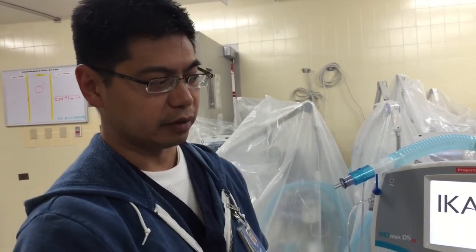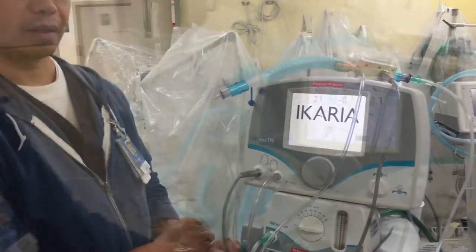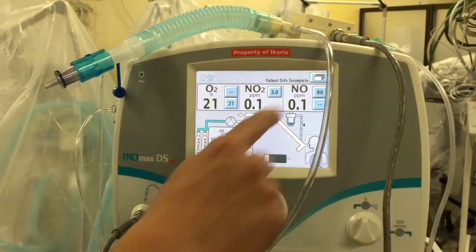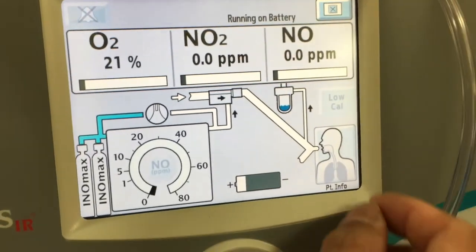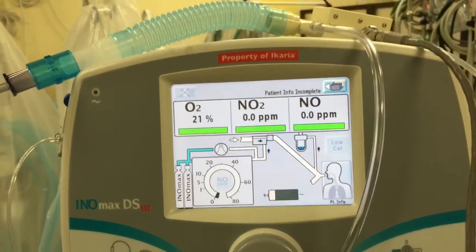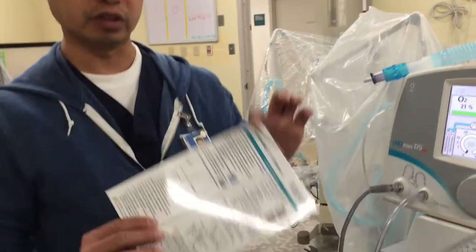The first thing we have to do after the pre-use check is to do a low room air cal. We have to wait until the machine performs its boot-up mode, and then we'll do the room air cal. Now the machine is up and running. All you have to do to perform a low O2 cal is press that screen, go from the main screen to the second screen, press Low Cal, press Low Cal again, and now it's calibrating. Just wait — all of these bars will turn green when it's done. See how that turned green after doing the low O2 cal — you're done. That's your first pre-use check, the very first part you have to do. Then you have to follow the rest of the directions on how to complete the rest of your pre-use calibration checkout.